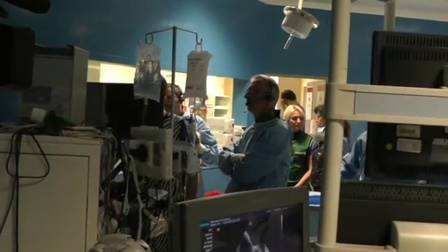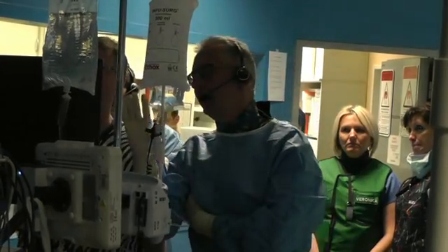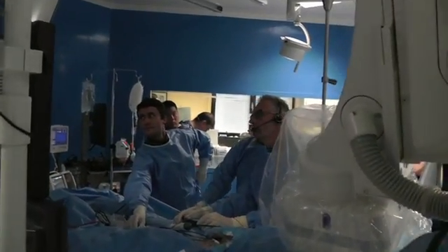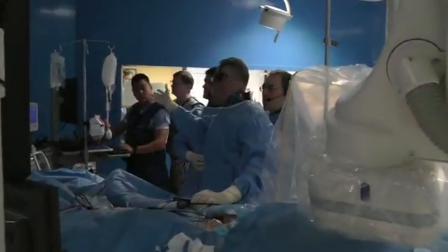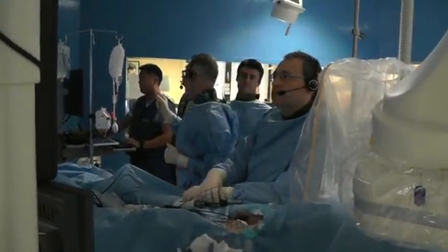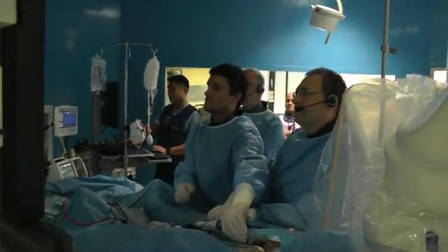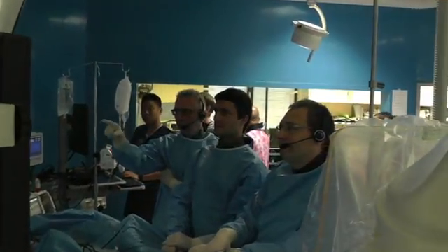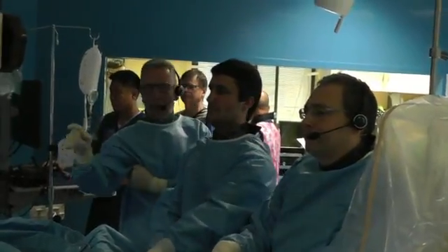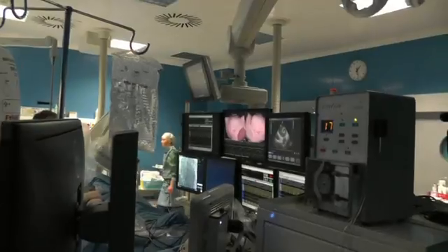This is the baseline map before — yes, this is the baseline. We didn't update anything. We can come back here. What we can see on the posterior wall, when we are going really into the core of this area of interest, is some kind of fractionation activity in the core.